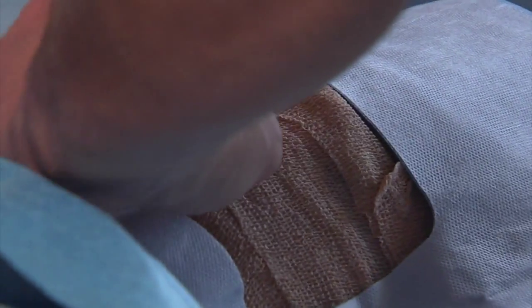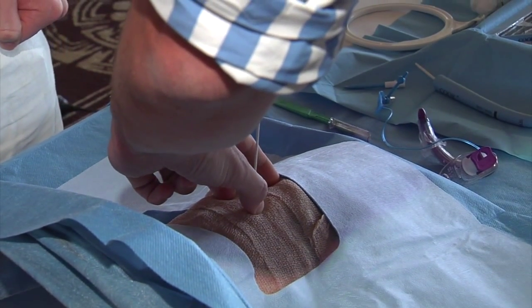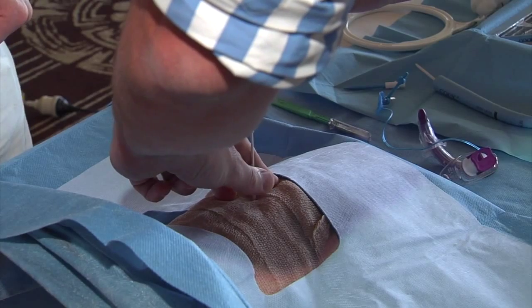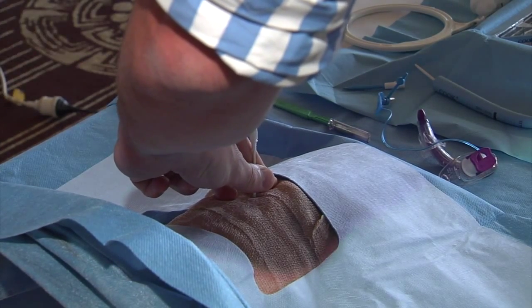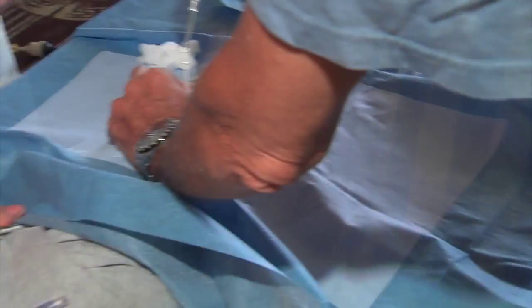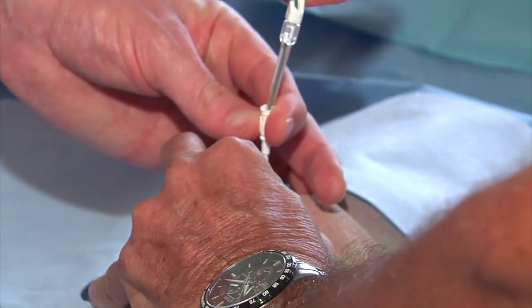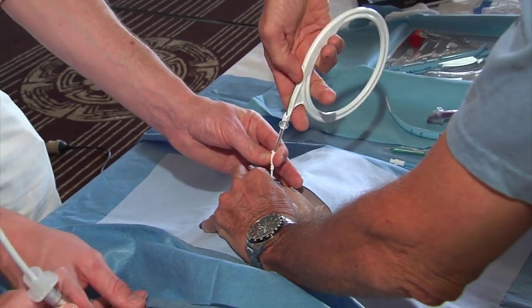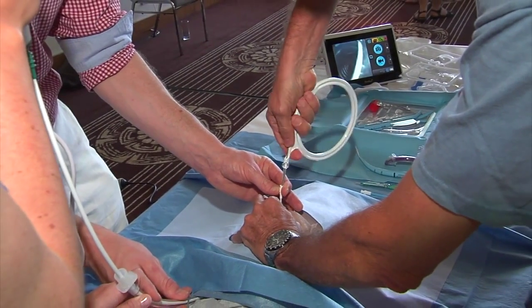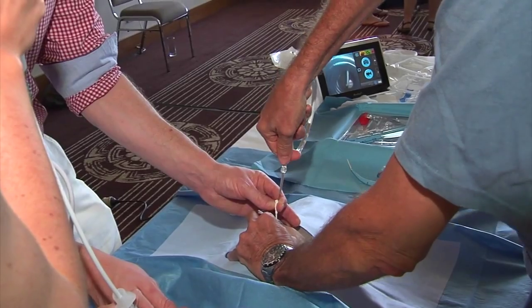Bring your bronchoscope back so it's protected. Often put a bit of saline in the syringe so you can see it bubbling to confirm entry. There's your cannula — right in the midline. It's especially tricky if you get lubricant on your fingers when feeding the guide wire.